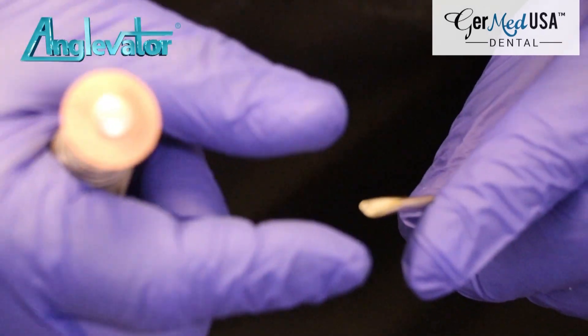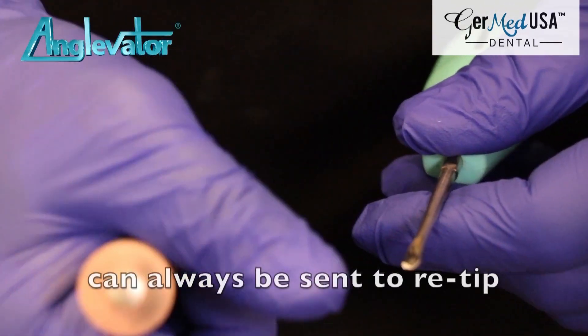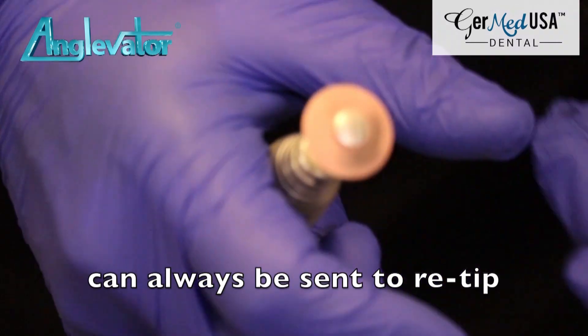If you bang up the angle too bad, send it back to us and we can re-tip it for you. But that will maintain the sharpness of your blade.